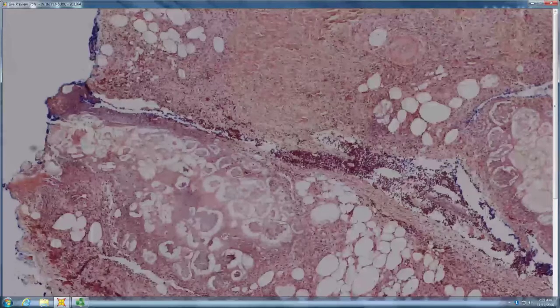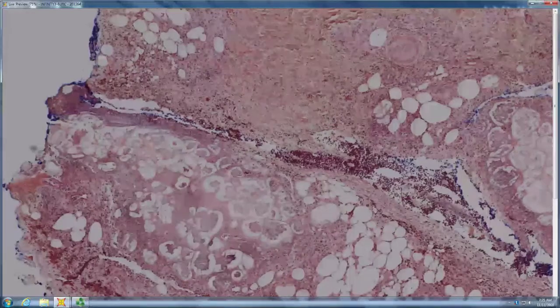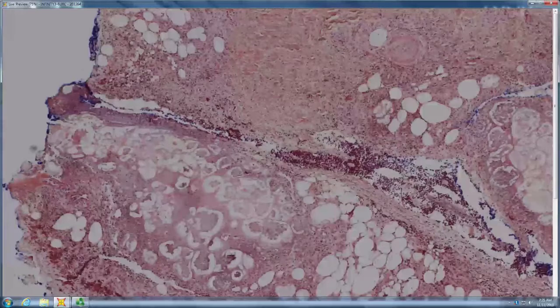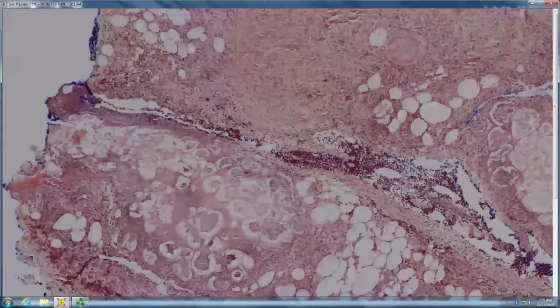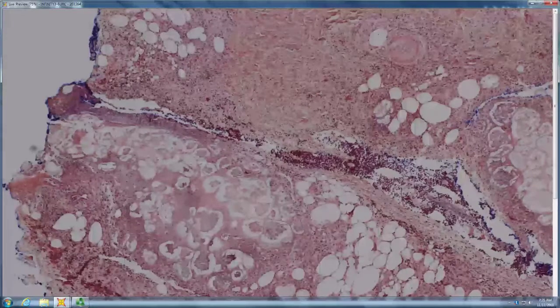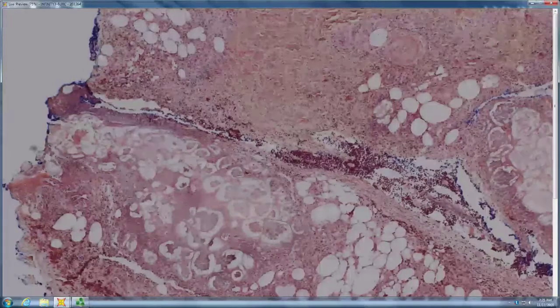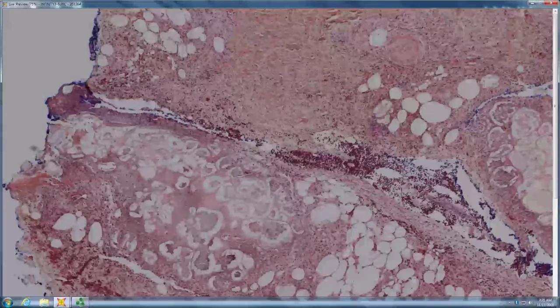And then what's the most important look-alike that can look just like pancreatic panniculitis? Mucor. Mucor in the fat can look just like pancreatic. And pancreatic is so characteristic that your tendency is, low power, pancreatic, next case. Look a little closer, because Mucor would be very relevant to patient outcomes. Mucor in the fat can be a dead ringer for pancreatic panniculitis.